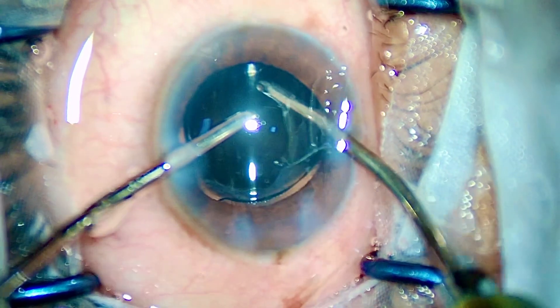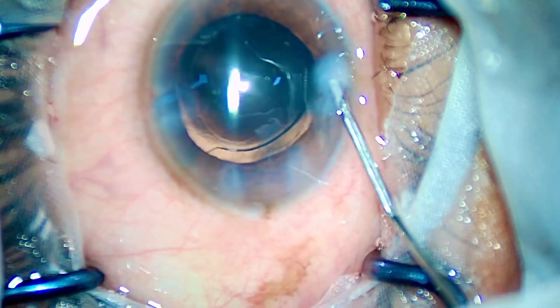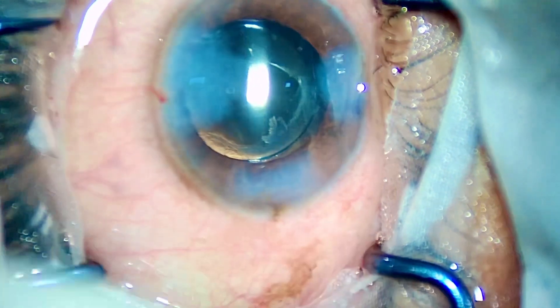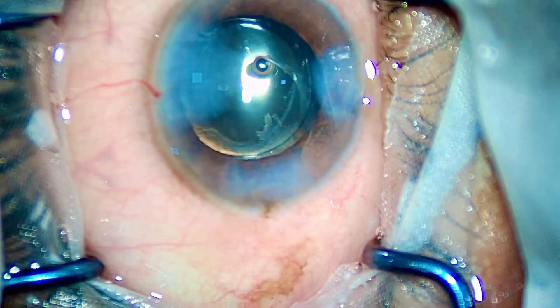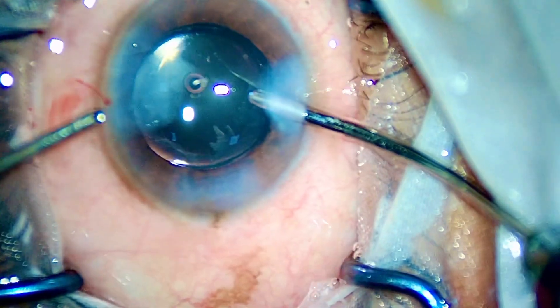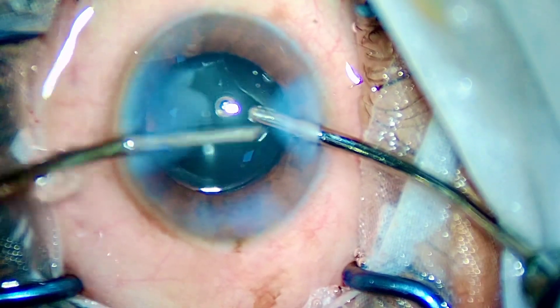Coming to the end of this case, I have implanted a monofocal IOL in this tough white cataract. This was a diabetic patient who never bothered to control his diabetes and came to me with a white cataract that had an uncommon consistency of the cortex, as you can see in the initial steps. That's all — the case is done. Once again, if you ask me FLAX versus manual, it is always manual FACO for me. I'll be posting two videos next week showing you how you can be the next brilliant surgeon, so that no one is able to distinguish between your rhexis and the one that FLAX makes.